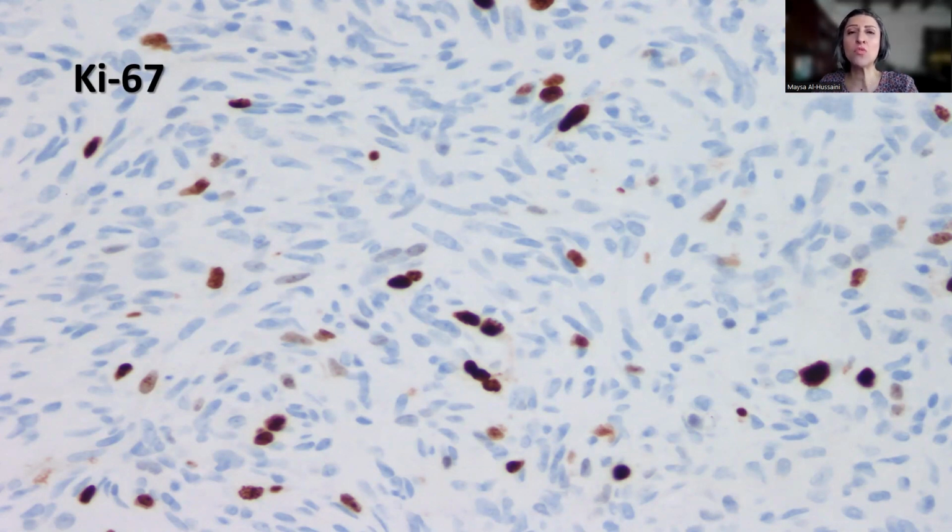And this is extremely important in any central nervous system tumor, because sometimes it's difficult, if you have like 4 or 5 slides, to just go and look for mitotic activity. So one way to help you find the areas with the highest proliferative activity is to perform Ki-67, and Ki-67 was interpreted as 3 or 4%.